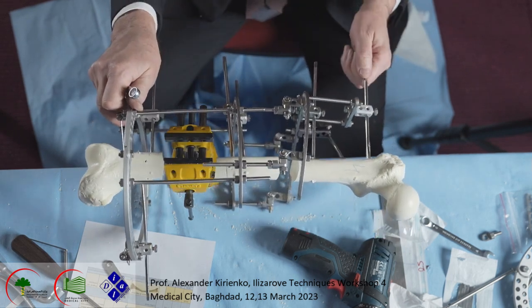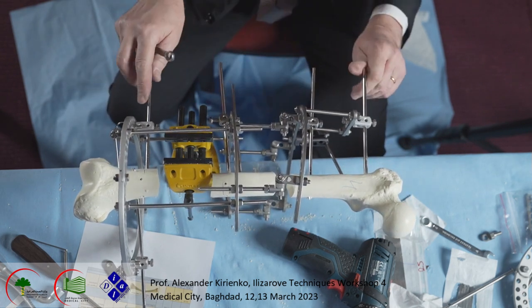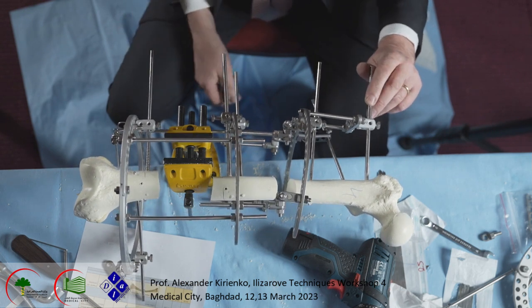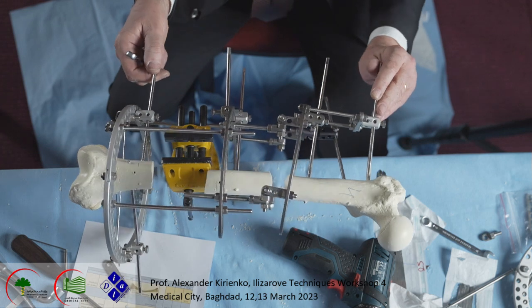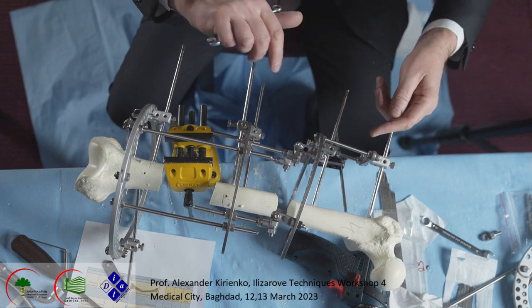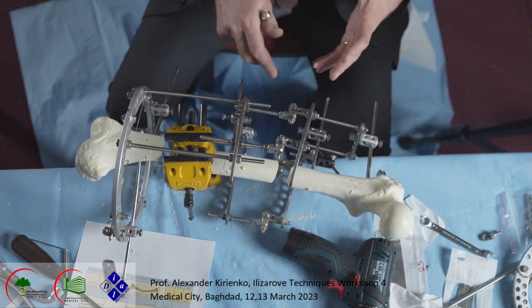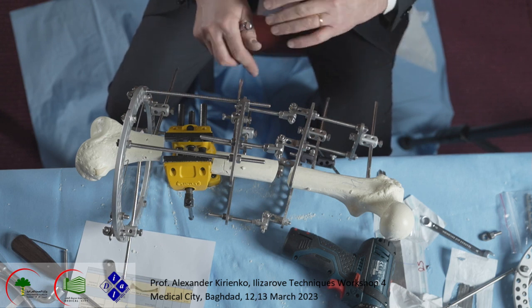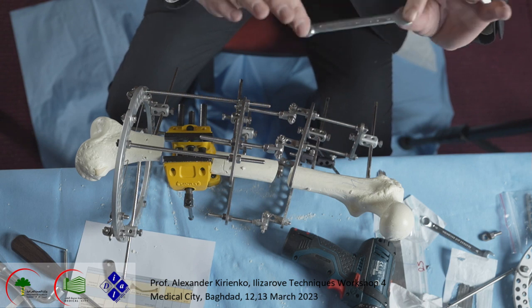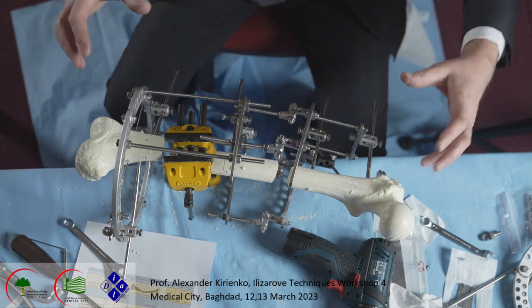The femur, if you see it, the proximal femur, is a little bit in varus. The more you do lengthening, the more it goes into varus here. Because the wires are bent, the tension of the muscles is too big, and we don't have a fixation like a wire fixation inside of the bone. It is only attached from one side and the other side is bent, and the femur goes into varus.